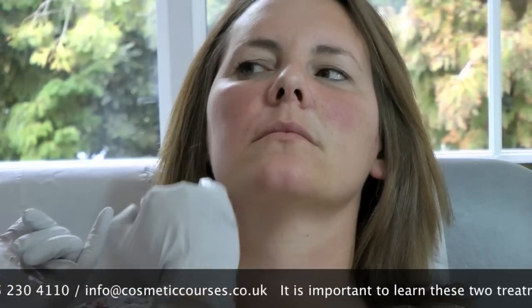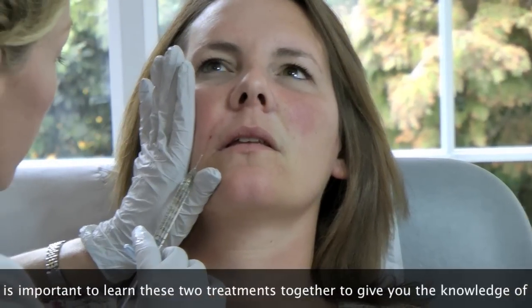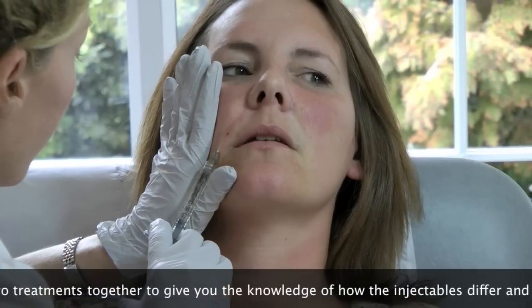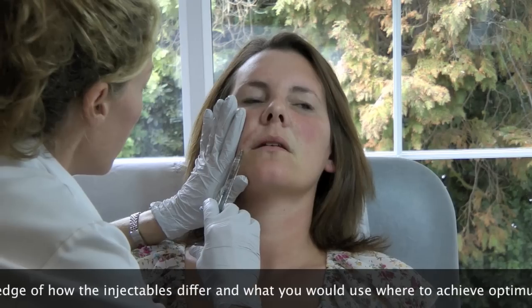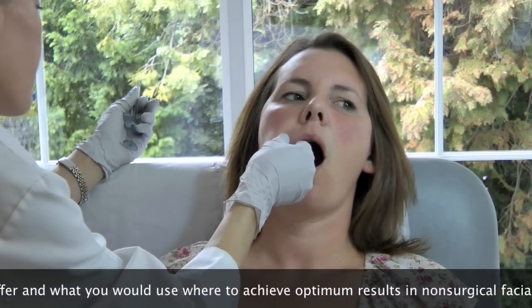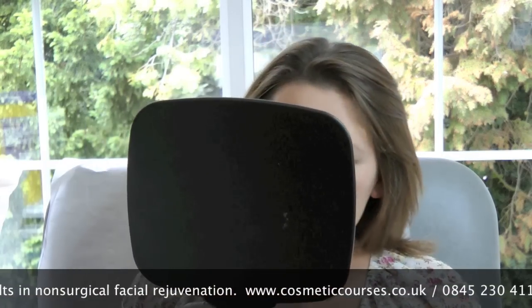So it's just softened, but not taken away for this bit up here. And then we've got the lower bit. This is a line, so I'm going under the line rather than medial to it — so your skin layers. So we've got a very natural improvement. I haven't even put the full syringe in there, so it's just softened it.